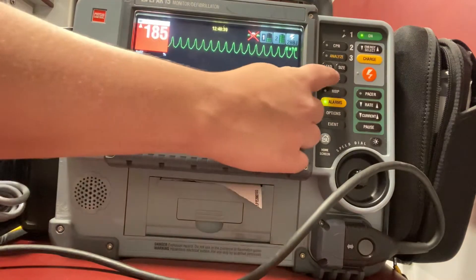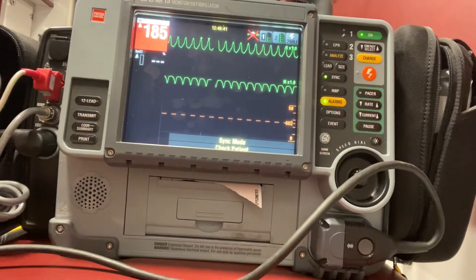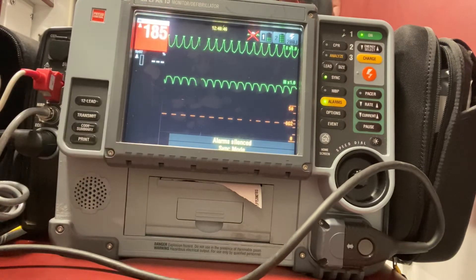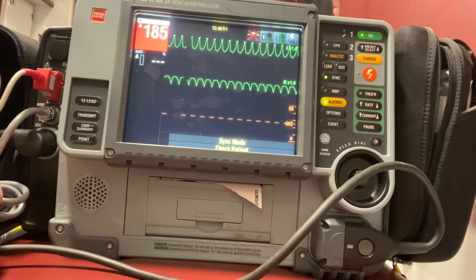First thing I want to do is press the synchronize button. I press this sync button here, and we'll see that I now have arrows on the top of my QRS complexes. That means I am synced and I'm now ready to deliver my synchronized cardioversion.